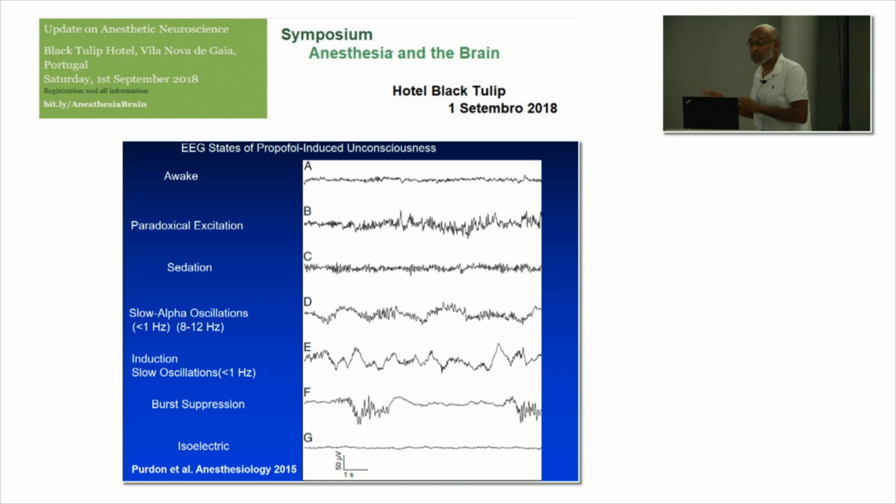Another key point here: the EEG under anesthesia is the strongest EEG signal there is. It has the highest signal-to-noise ratio for anything that the EEG is used for, whether it's looking at sleep, looking at coma, or doing cognitive studies in patients. And you saw why here. Pretty much for anything else you use the EEG for, there's movement, so the movement artifact already colors the problem.